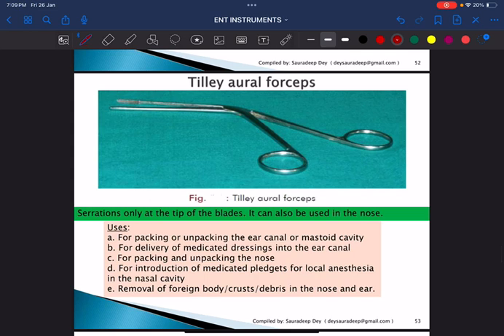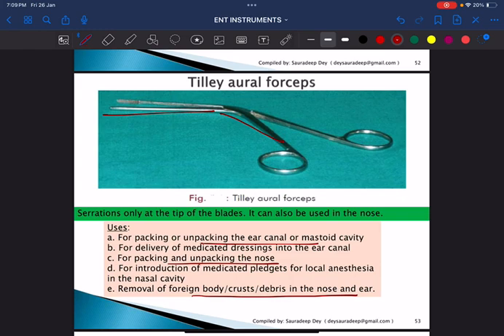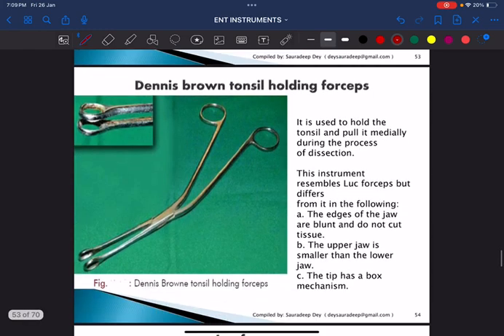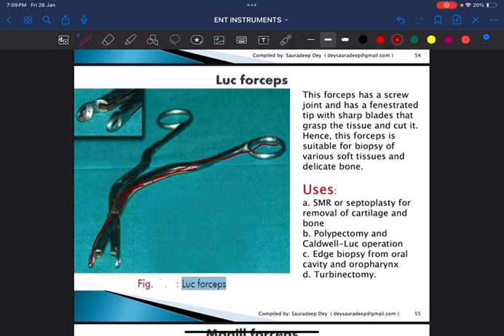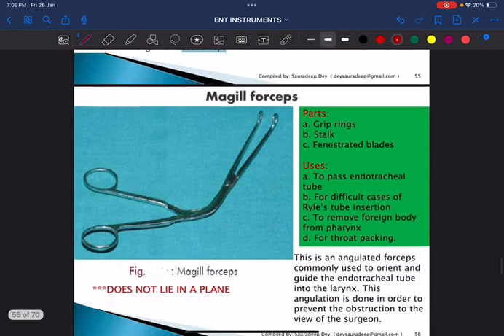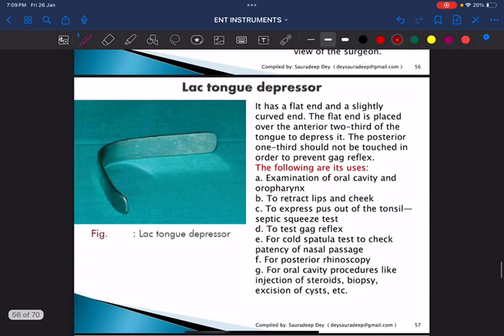This is Tilly's aural forceps — note the long bit with a bend. It is mainly used for packing and unpacking the ear canal, packing and unpacking the nose, and removal of foreign bodies in the nose. Next is Luc's forceps, which has multiple bends and no lock. It is mainly used for the Caldwell-Luc operation and in submucosal resection or septoplasty.